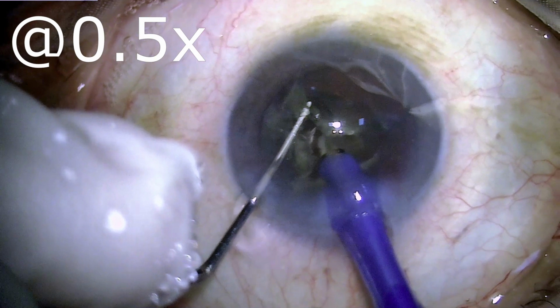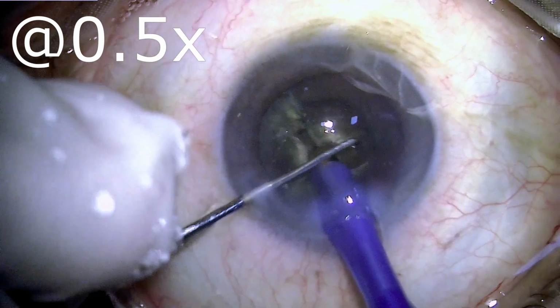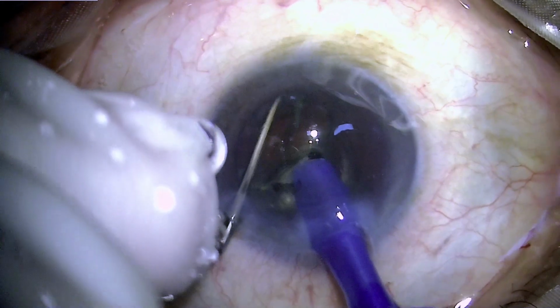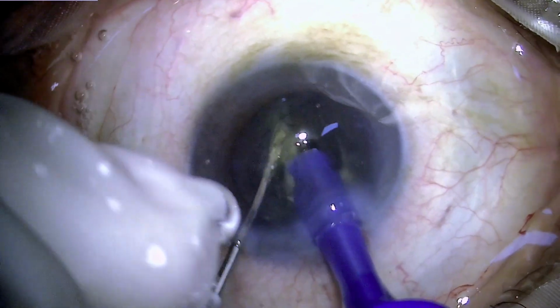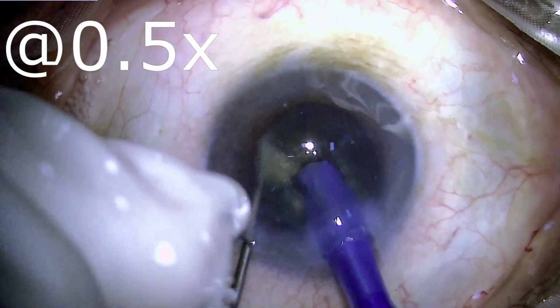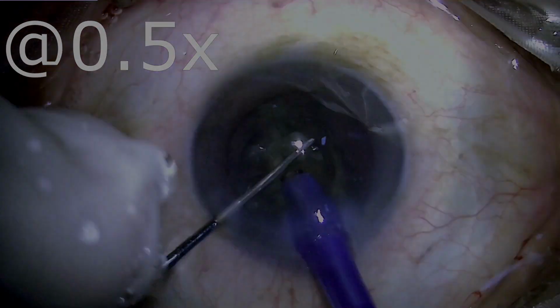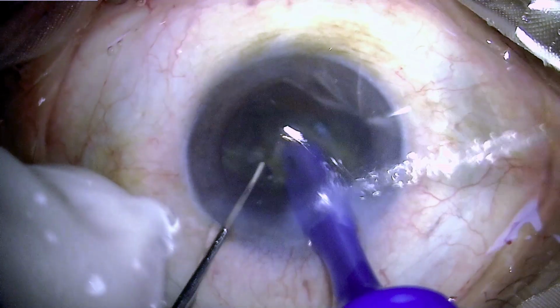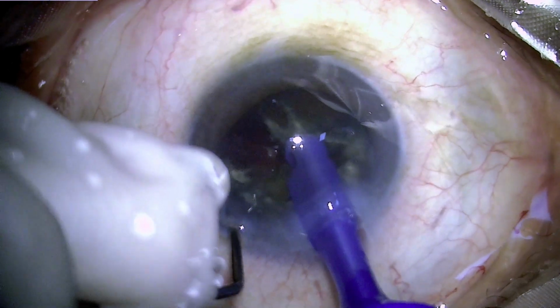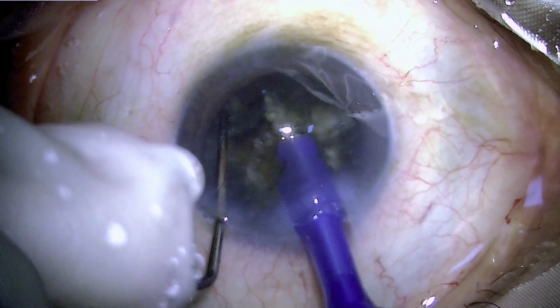So we can see that in slow motion, and this occurred repeatedly, and this was not something which I used to experience with the machine which I was using. So we can see it again happening once the phaco chop has been conducted, and this is a dangerous situation. So what I did was I assumed that this is probably a bad day, something which is not accounted for, and I switched to a lower vacuum setting and I started doing the surgery as usual.